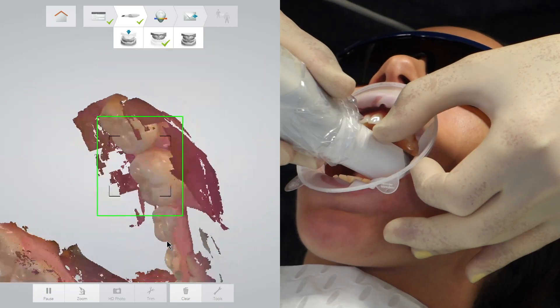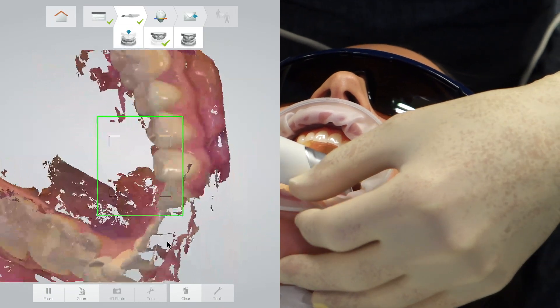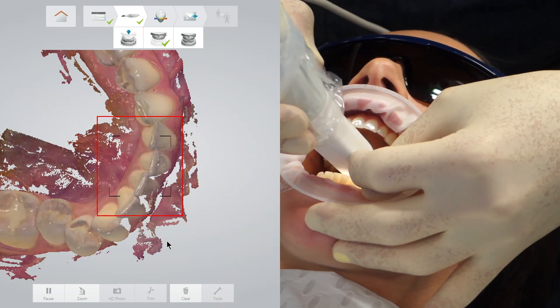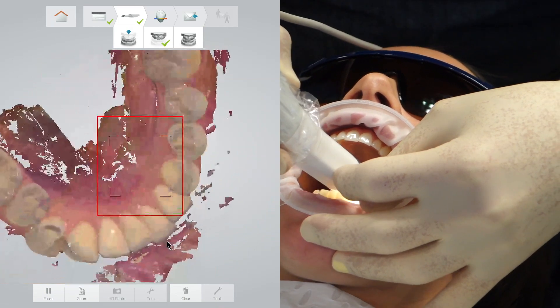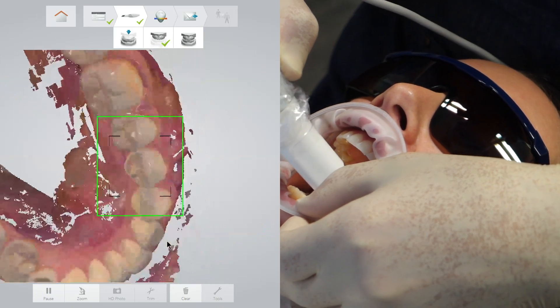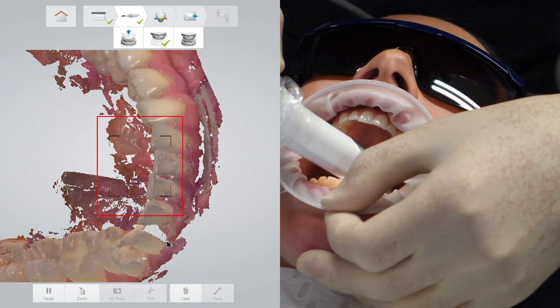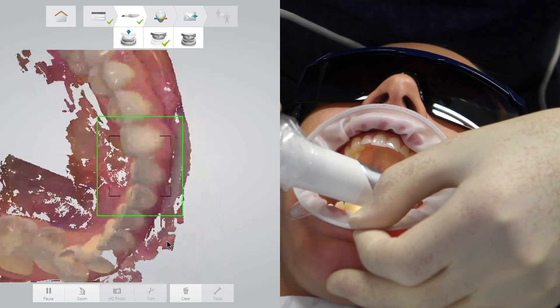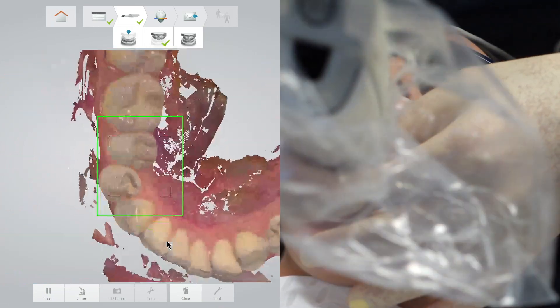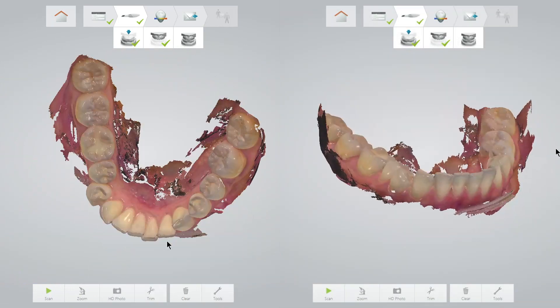Even after four years I still find the lower incisor teeth difficult, but I find that if I go back slowly to the original molar teeth that I have scanned, I can eventually outwit the system — and at times it does feel as though we are trying to outwit it. I often go back over areas I have done already, as I can see there are small gaps that I need to add to. This is a wonderful aspect of these digital scanners. I modify how careful I am and how many gaps are present depending on whether I am using the digital impression for an upper splint, a study model, or a crown.